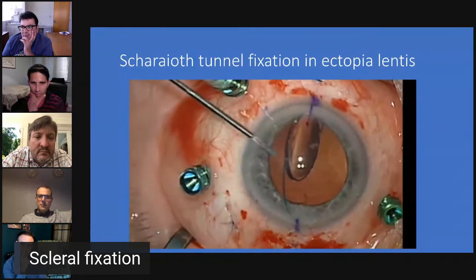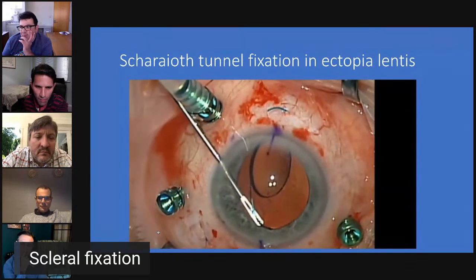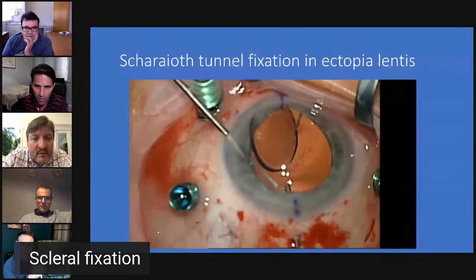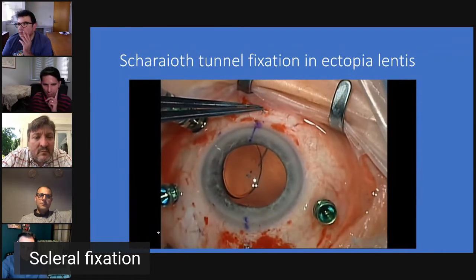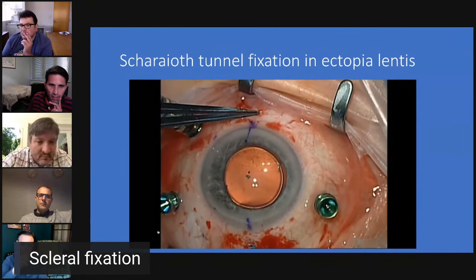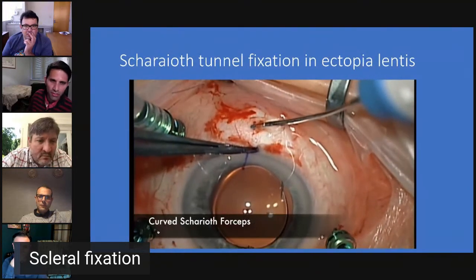And then a similar maneuver for the proximal haptic, which you can manipulate through the cornea, sort of a handshaking technique. And then you can see there grabbing the tip of the haptic out through the sclerotomy. Now this is superiorly. That is all fine. And then burying them into the tunnel.